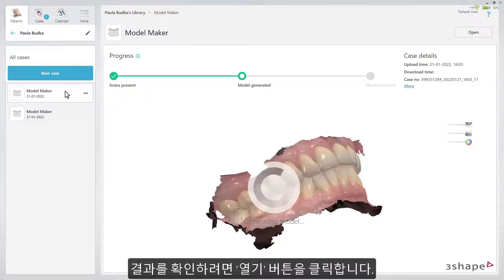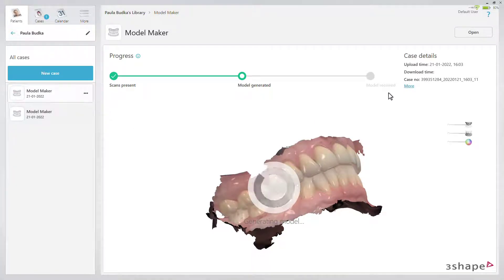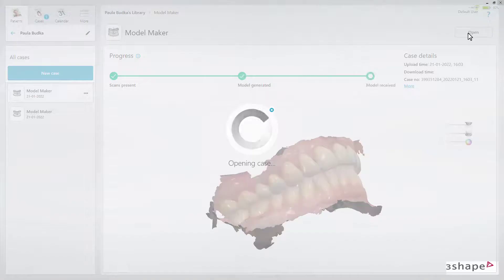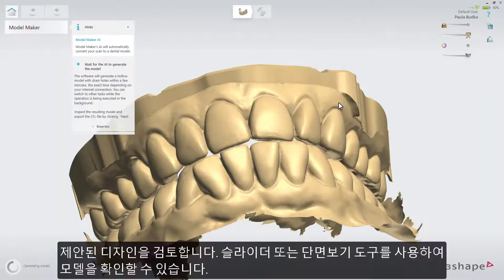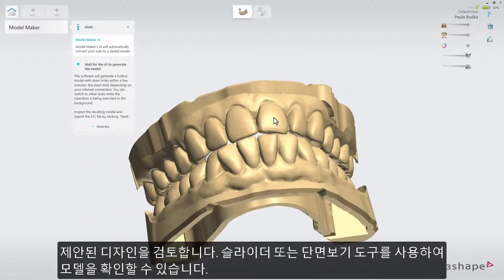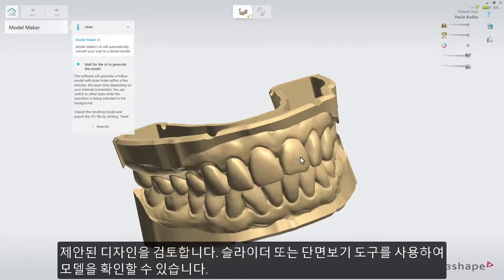To check the results, use the Open button. Inspect the proposed design. You can use the sliders or the cross-section tool to inspect the model.